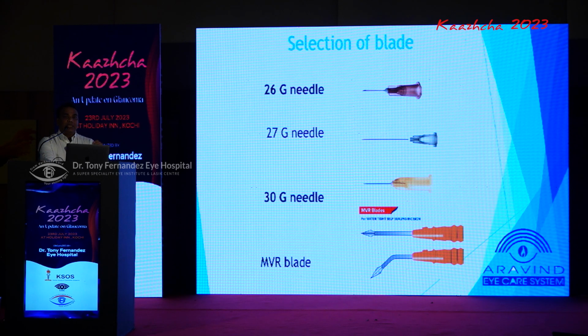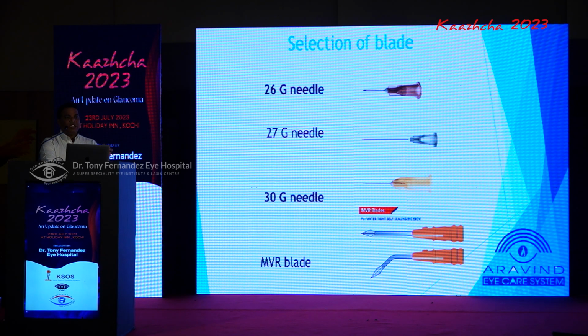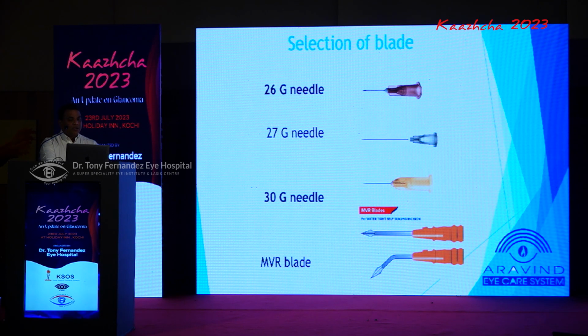Then what blade should you use? It all depends upon what works in your hand. Either a 26 gauge needle, 27 gauge needle, 30 gauge needle, and some people use the MVR blade. I personally say, whatever works in your hand, go for it.